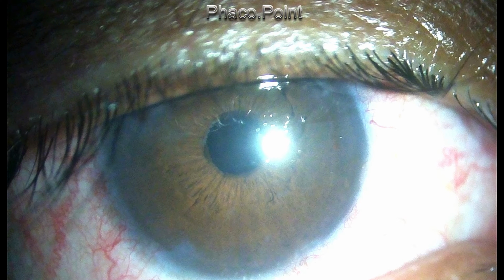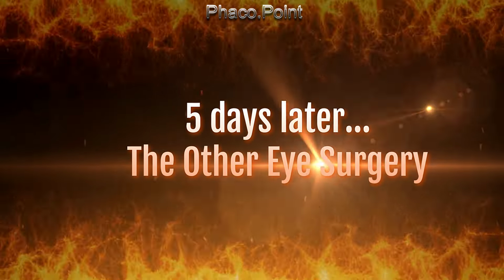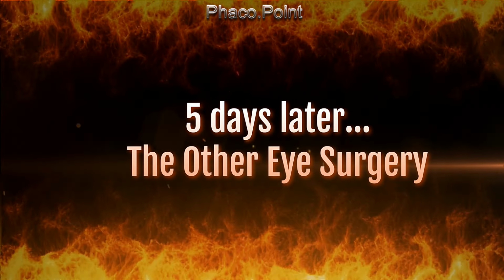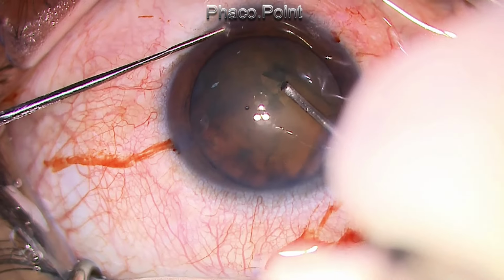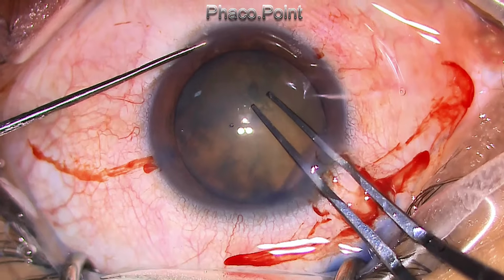This was the post-op immediately 24 hours after the surgery. The patient's cornea was extremely clear. The patient was happy. He had an unaided 6/12 vision. Now 5 days later I took up the other eye for surgery, and even though we are operating on a similar eye with a similar set of difficulties, things don't go identical in two different cases.